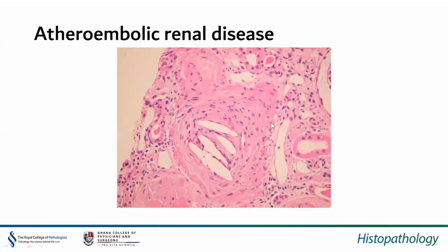This is atheroembolic renal disease, which occurred in a patient who had undergone angioplasty a few weeks before the biopsy, and then he presented with acute renal injury. And you can see this vessel with the typical cholesterol clefts. This is its characteristic appearance.